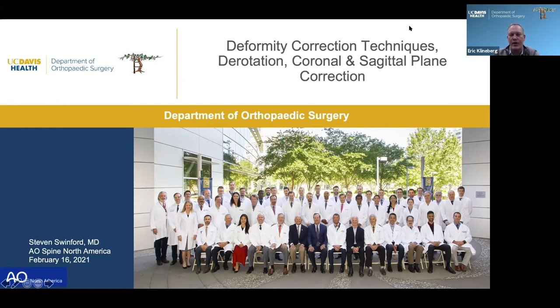Last question, and then we'll move on to your portion, Steve. Is there any change for the thoracolumbar or lumbar curves in terms of technique? I'm not sure exactly what that question means, to be honest, but I think the question is how do we derotate that as different distal segments? And the key part is at the screws of the very distal portion, I usually over-rotate them the other way, to spin those around. And so that usually helps correct those other segments and correct that unfused spine. So that usually works pretty helpful.